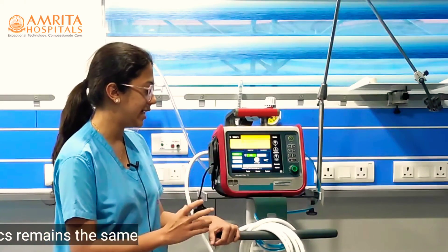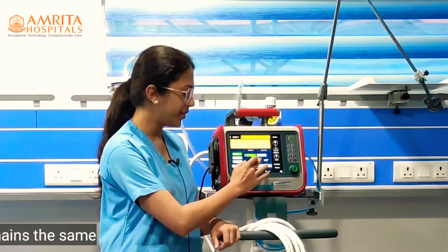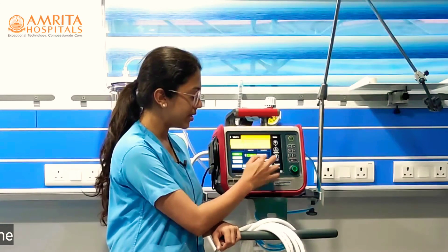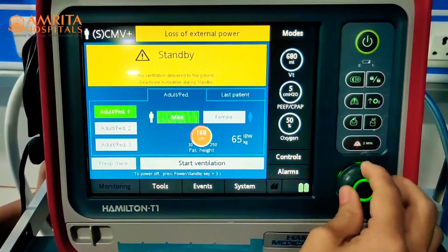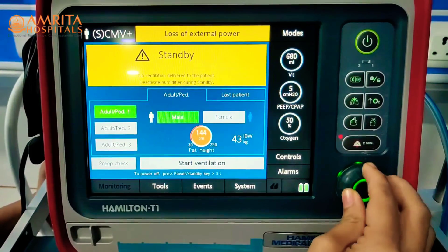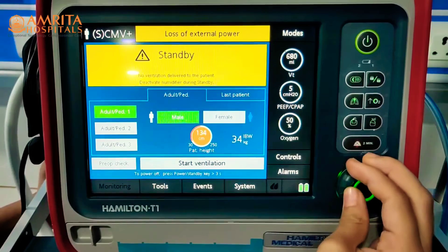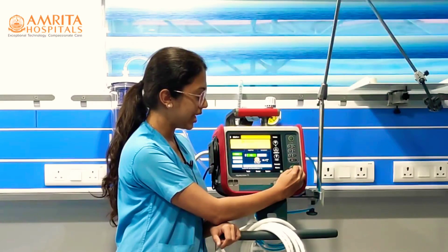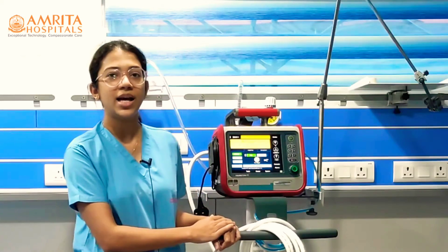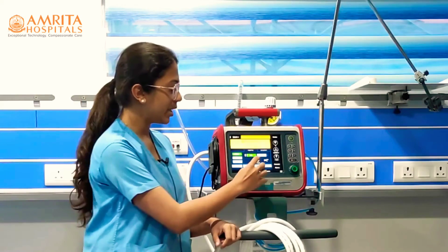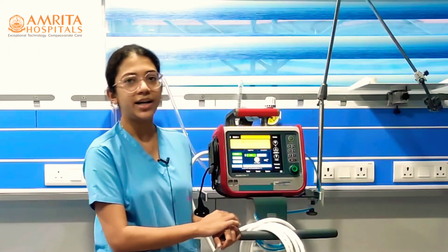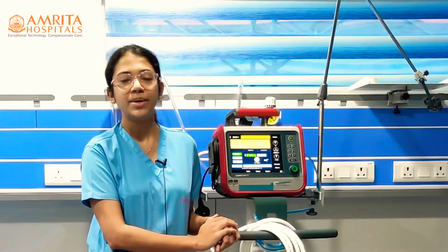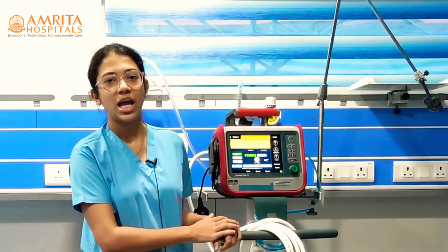Here I have a Hamilton T1 ventilator. It asks for the height of the patient. I can change the height by turning this knob, and as the height changes the ideal body weight also changes. So in this ventilator, the device itself calculates the ideal body weight based on the height entered.